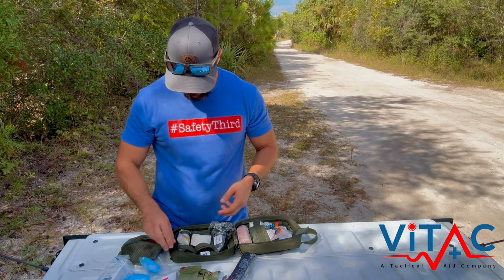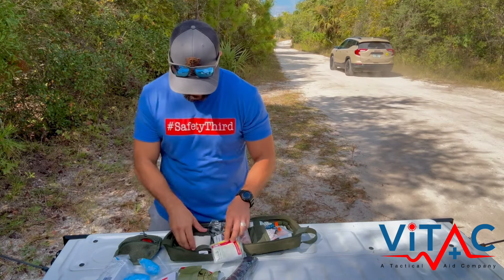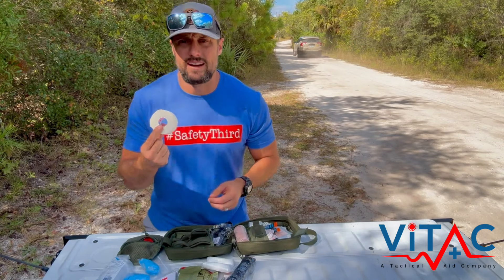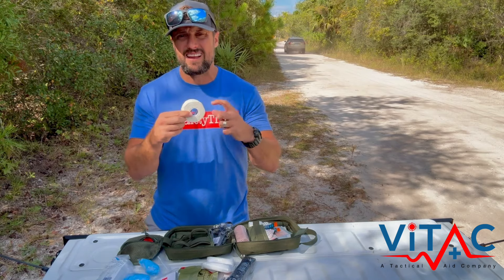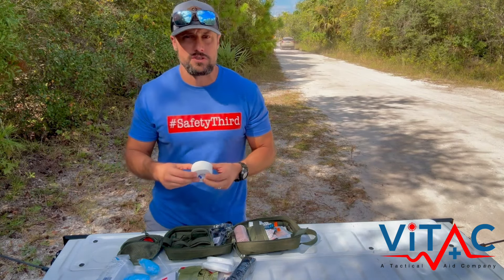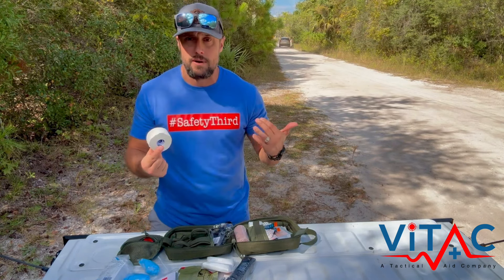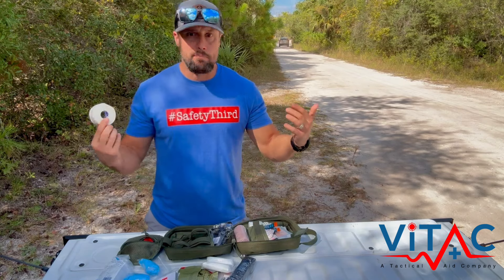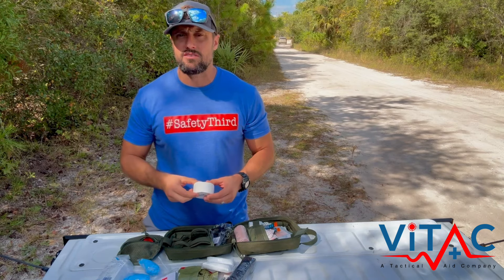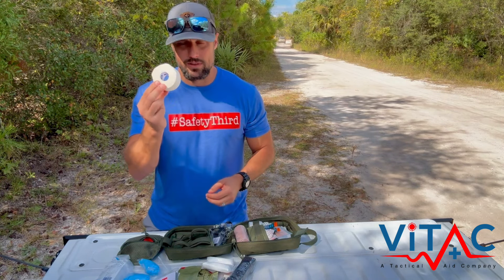You've got an emergency blanket and a triangle bandage. You've also got athletic tape — the reason we put athletic tape in versus surgical tape is that it has a little bit of stretch, it's wider, and it's still very adherent so you can use it to address wounds. But it also really works great for stabilizing joints you might have twisted or sprained. Biggest injury ever is twisted ankles, and then knees, fingers, and wrists — that's why we put this in here.